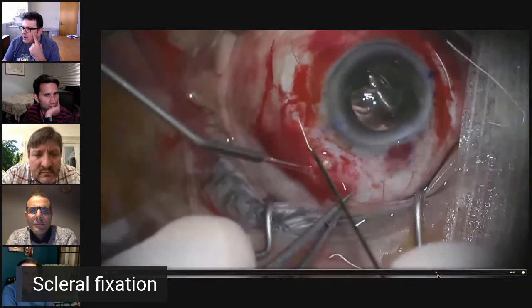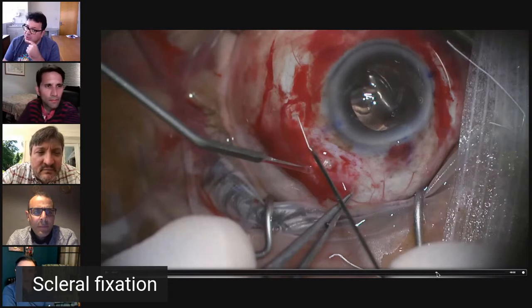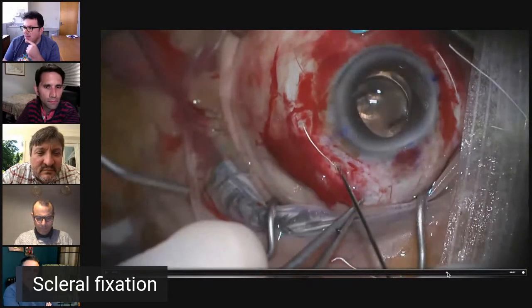And then how many knots have you done, Ahmed? I do 3, but having heard Chris now, maybe I should do a bit more, but I tend to do 3. Okay. 3-1-1. Yeah? I got a bit worried. I do 3-1-1. Yeah, because I usually did 3 and that's it, but if they slip.